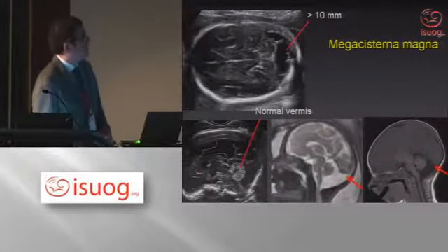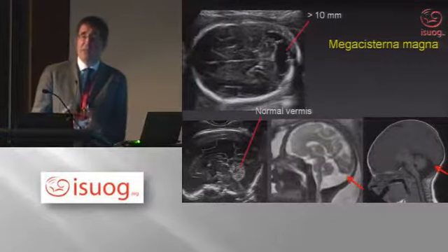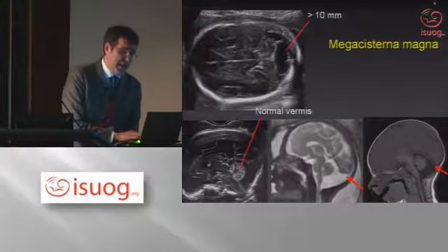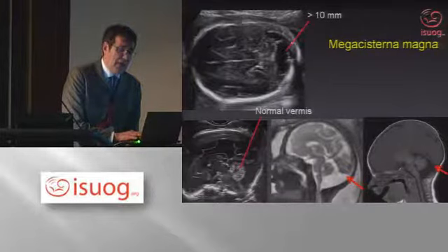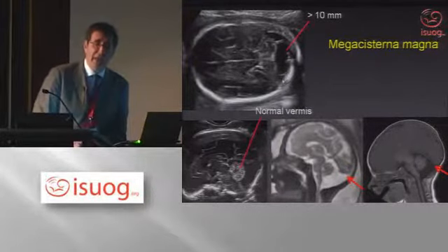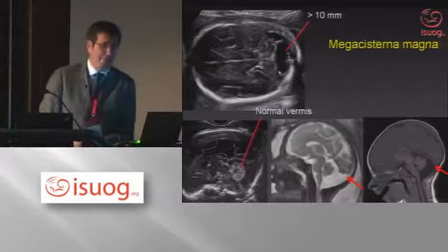Well, the impression that in reality, when you have a large cisterna magna, it is not the cisterna magna which is big, but it is the Blake's pouch that is dilated, mainly comes from recent studies with ultrasound, in which when you have a very large cisterna magna, you no longer see septation inside it, but you see something that really resembles a cystic collection with the walls of the cyst.